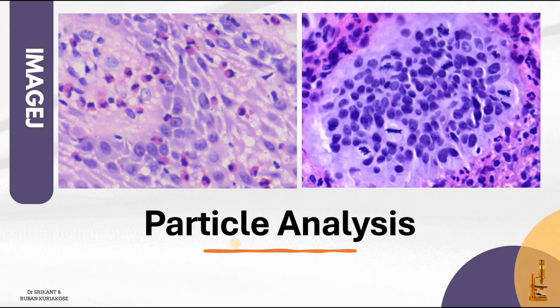Today we are going to talk about slightly intermediate to advanced analysis called particle analysis. Now particle analysis can be used in many setups. Since I am a histopathologist, I am putting forth two images here. On the right side you can see a tumor, and my idea is to count the number of cells present inside the tumor. On the left side, you can see these specific pink colored cells. These are the eosinophils. I can even threshold the images to actually count the number of eosinophils in this background. So all this can be automated.